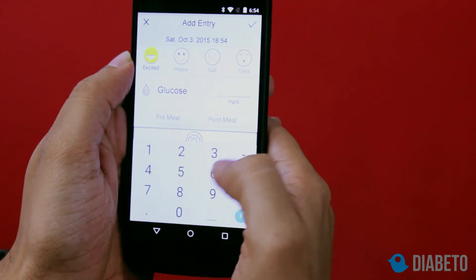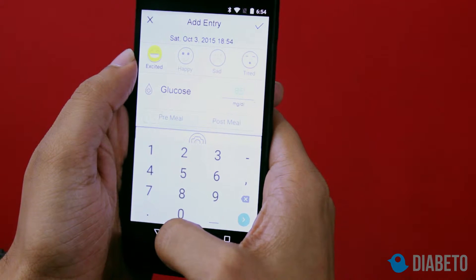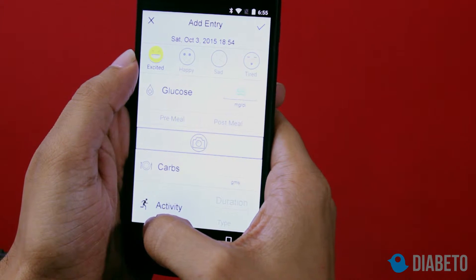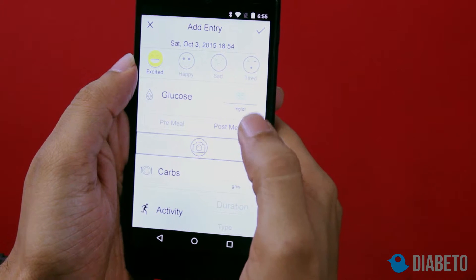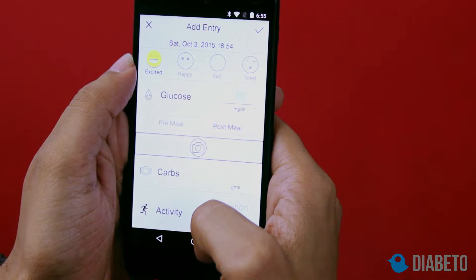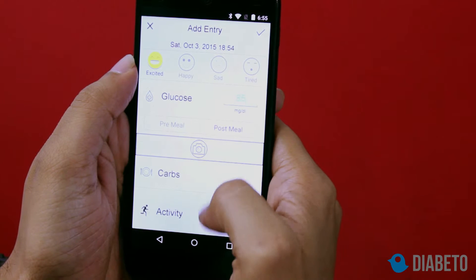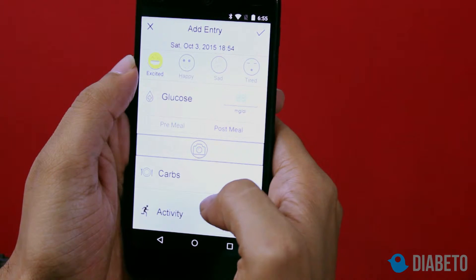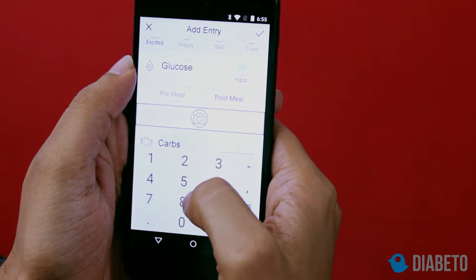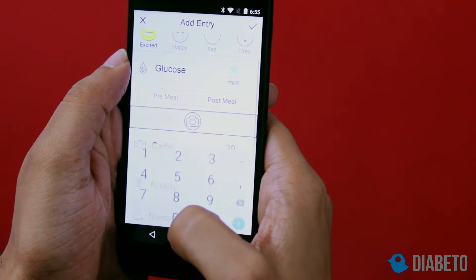I'm feeling excited — my blood glucose was very nice. It was 85 mg/dL. I had actually eaten a small snack, so I'll click on post meal. I can also take a picture of the food I've eaten. The carbs — it was a small snack, about 20 grams.